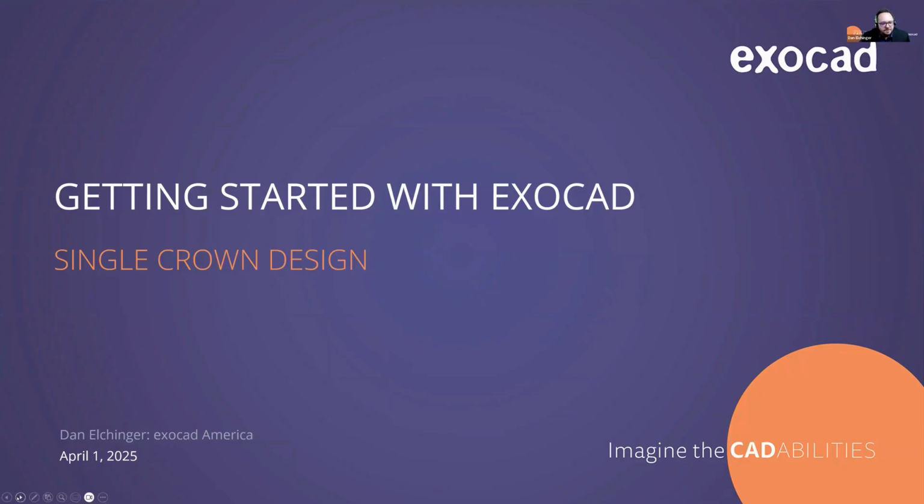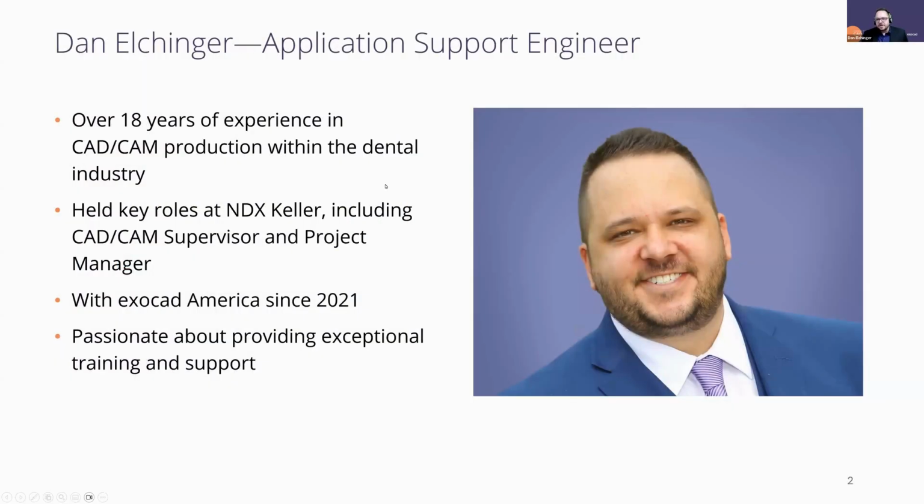So with my background, primarily within the laboratory world, you guys can see my bio here. I won't read it all out, but as I'm sure a lot of you can relate, single crowns are a big part of our world in the lab industry. So with getting started with Exocad, we're going to cover the foundations of design and expose you all to some of our latest features. So very excited to share. It's going to enable a lot of productivity gains for you and your team. So let's go ahead and proceed.